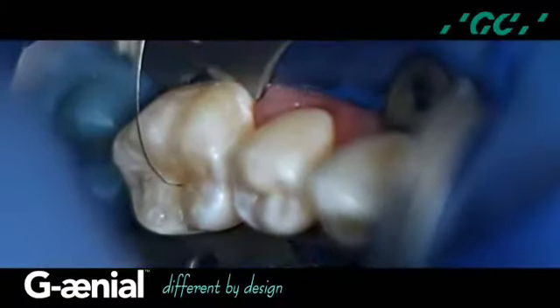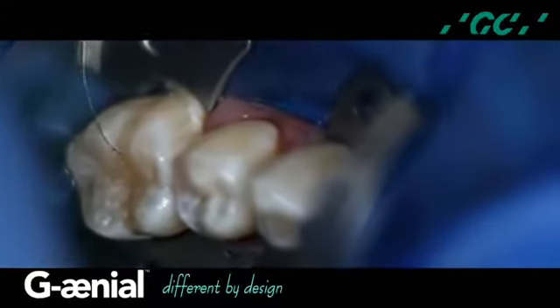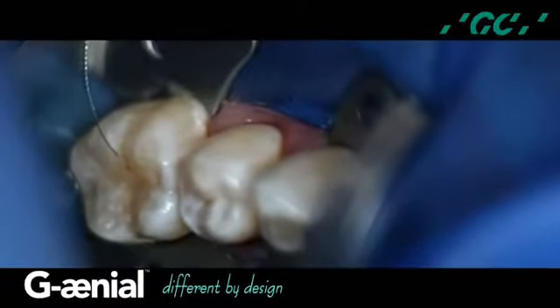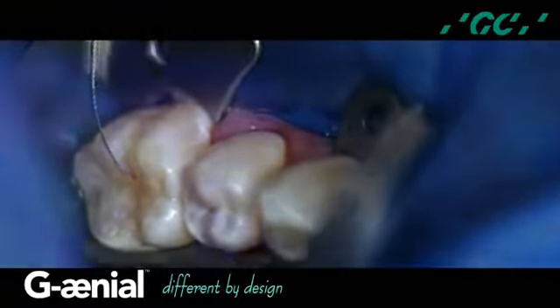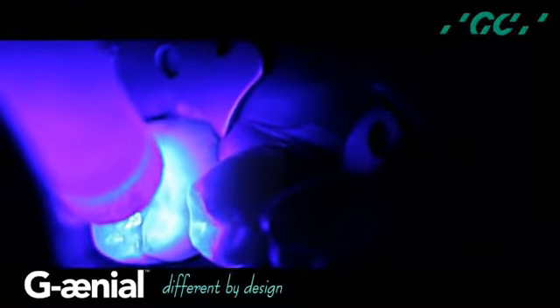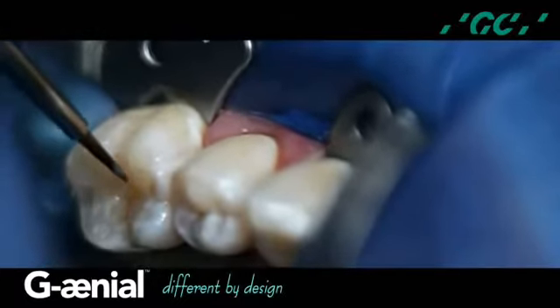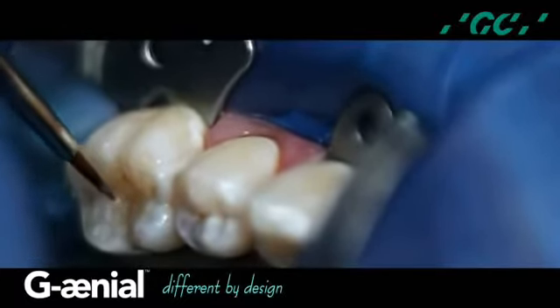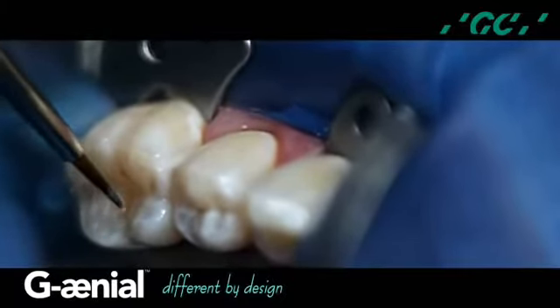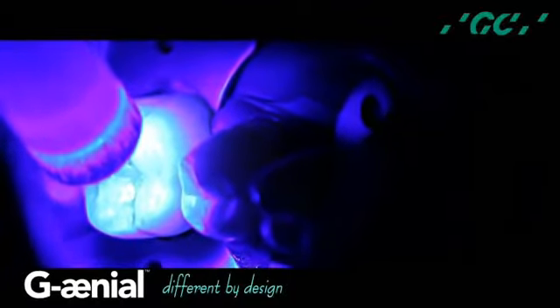I use an ochre tinted color modifier, placing it with a 08 endodontic file to create occlusal fissure staining, a very natural effect within the final dentin layer, and light cure for 40 seconds to stabilize the color. A final enamel layer, an AE shaded G-aenial universal flow, is applied over the entire dentin layer, maintaining the anatomical morphological contours, and a final 2-minute post-cure which increases the hardness.